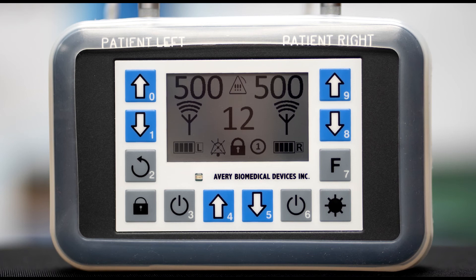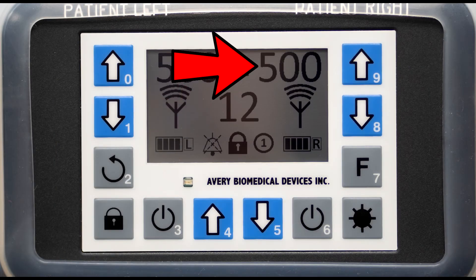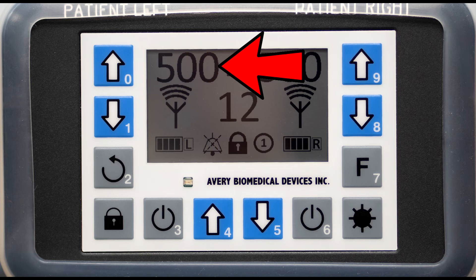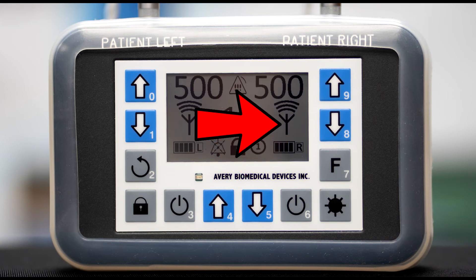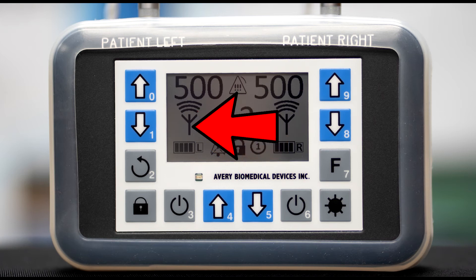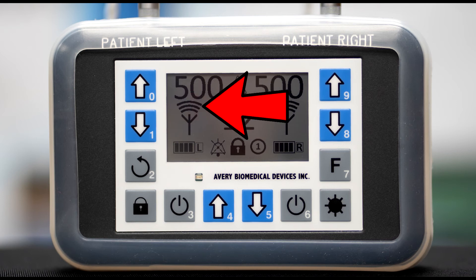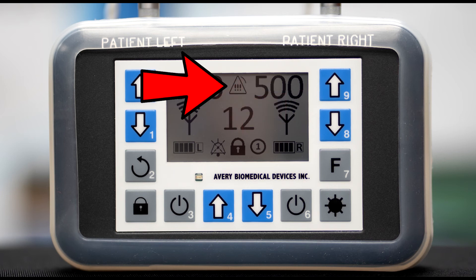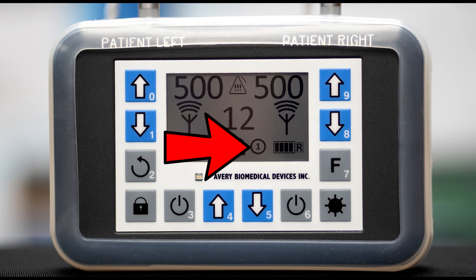The graphics display shows all the relevant stimulation parameters as follows: respiratory rate, right and left amplitudes, right and left battery charge status, right and left antenna connection icon, right and left RF signal indicating that the antenna is transmitting signal, and alarm icon. Keypad lock icon indicating that the keypad is locked.